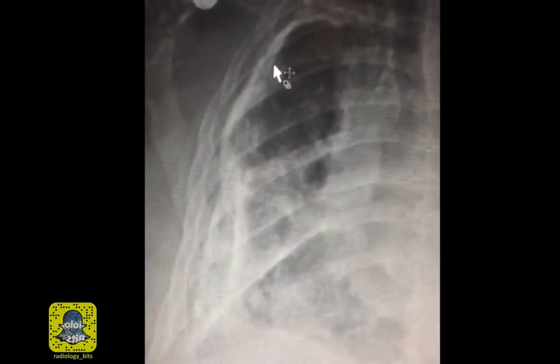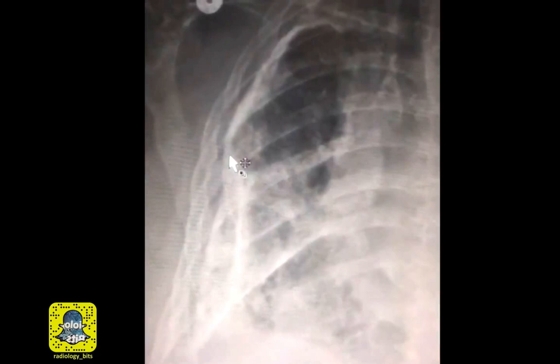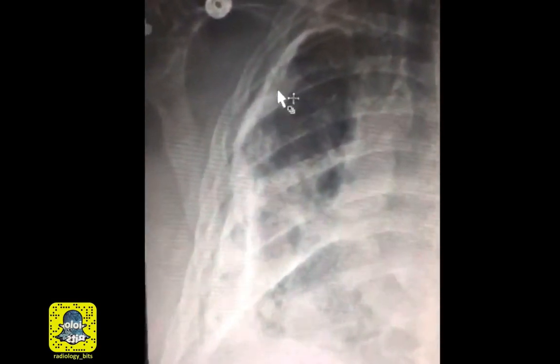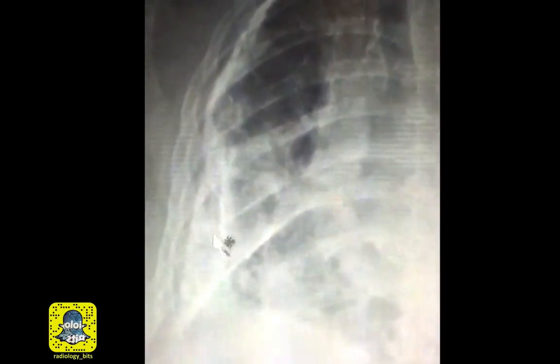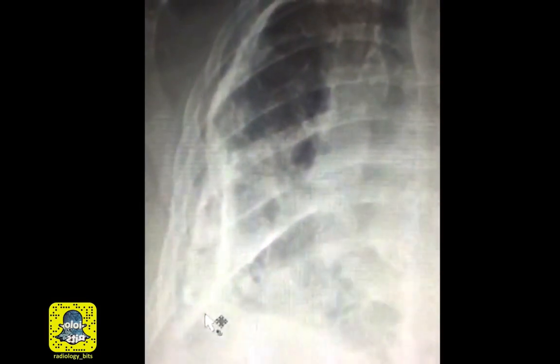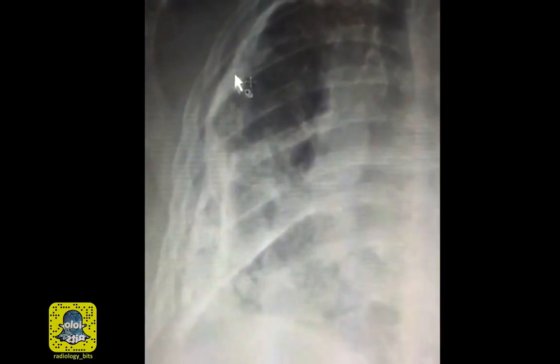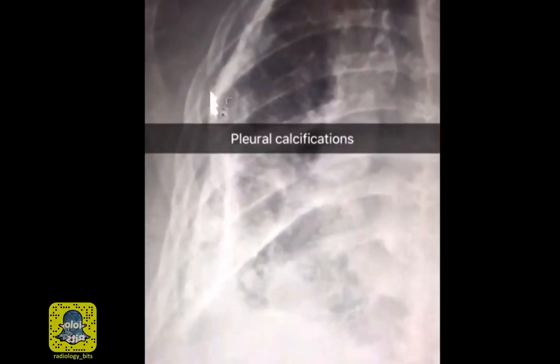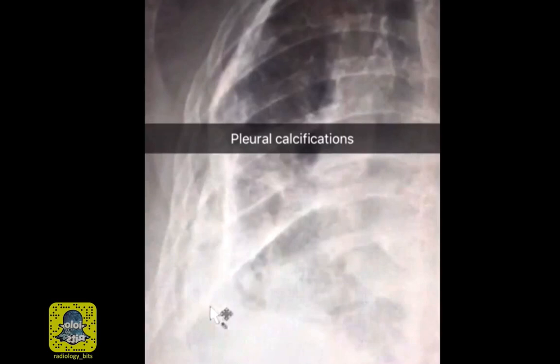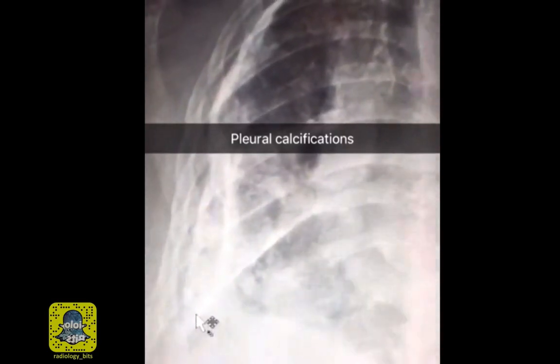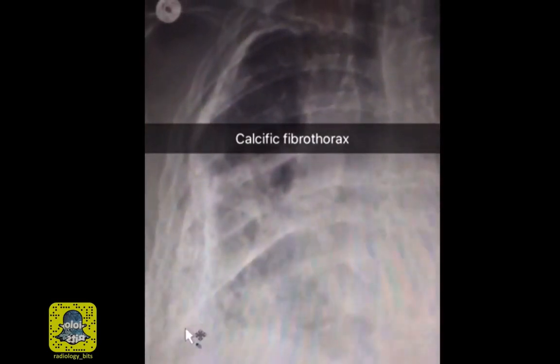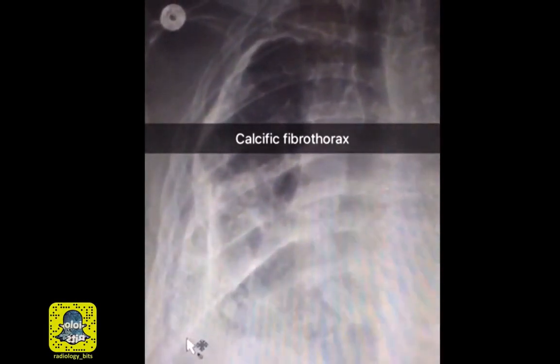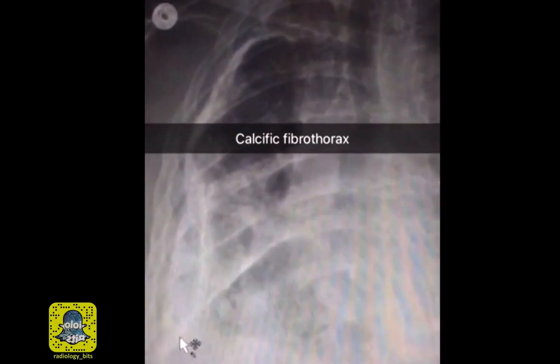Note that this line is very thick and it has a high density that's equal to or more than bone. This high density is consistent with calcification, and the way it follows the edge of the lung suggests that it's in the pleura. So this here is thick calcific change of the pleura. If you put all these findings together — the thick pleural calcifications and the decreased lung volume — this is consistent with calcific fibrothorax.